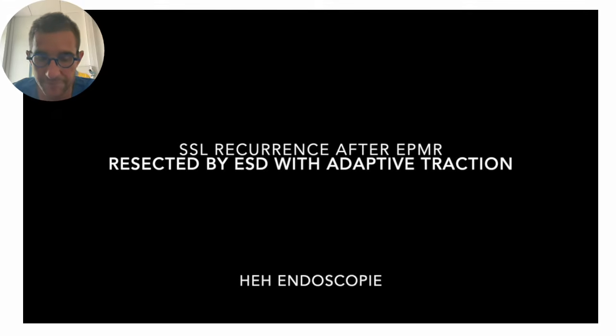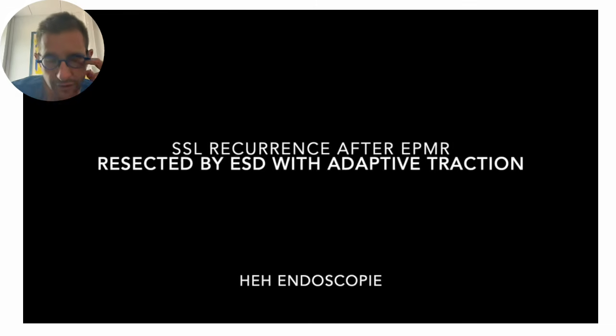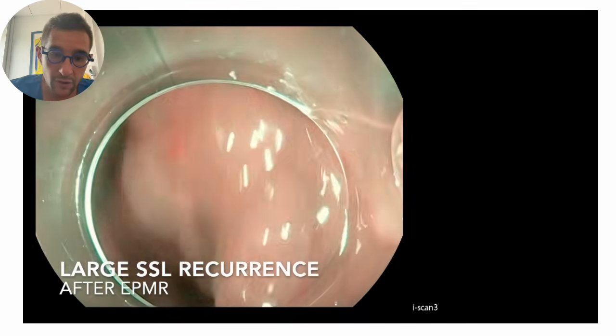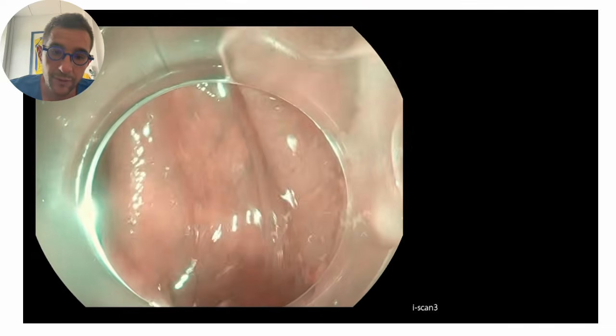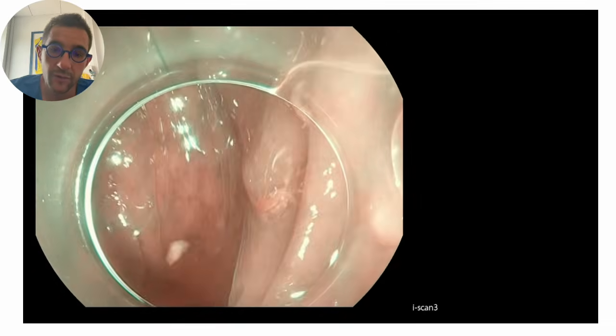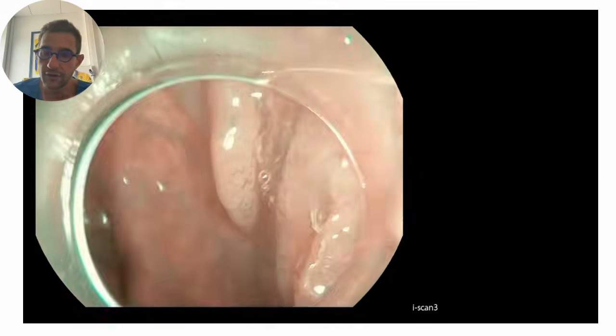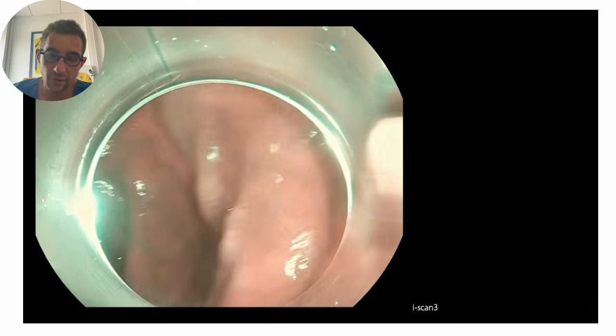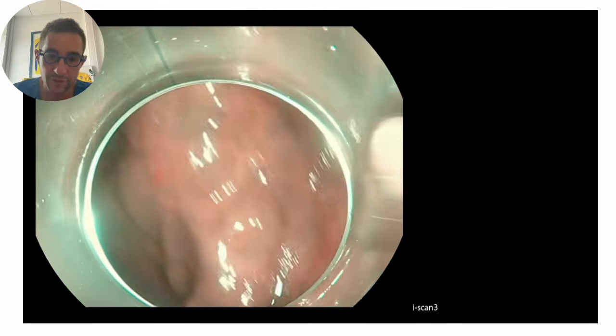Another example, which was done for an SSAP recurrence after piecemeal EMR. We can see that it's probably more an incomplete resection because all the oral part was removed with a strong scar and all the distal part was remaining.